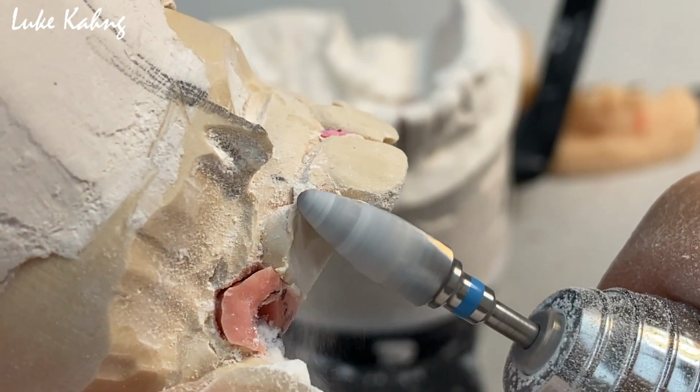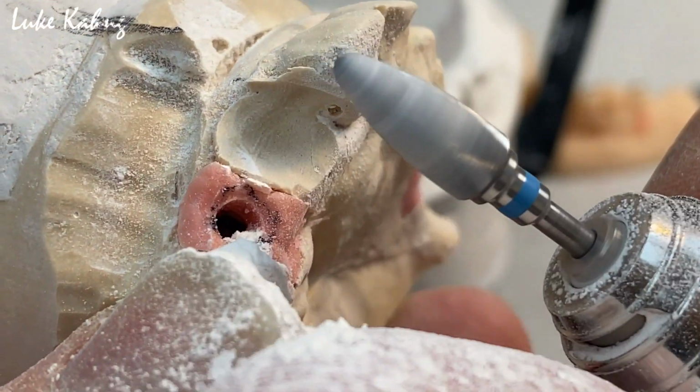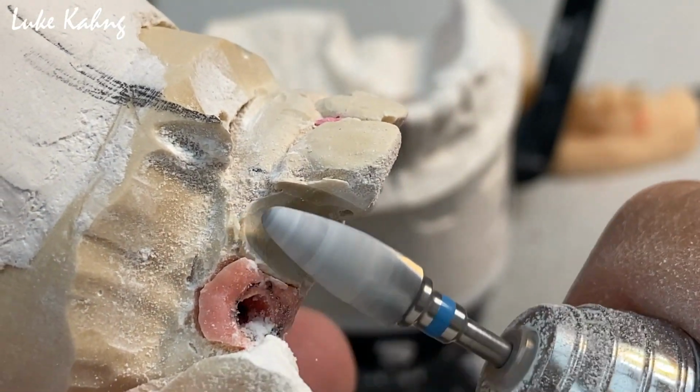I think this is a bubble line here, right? Just the starting.